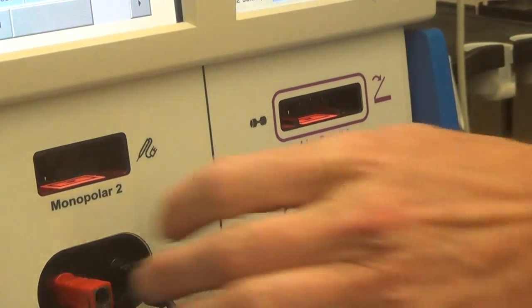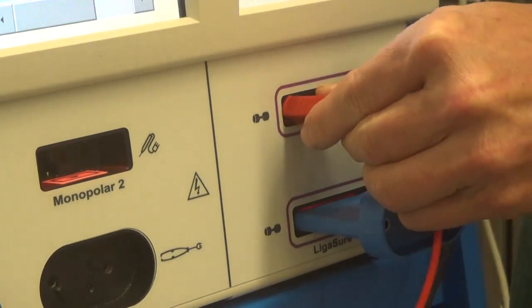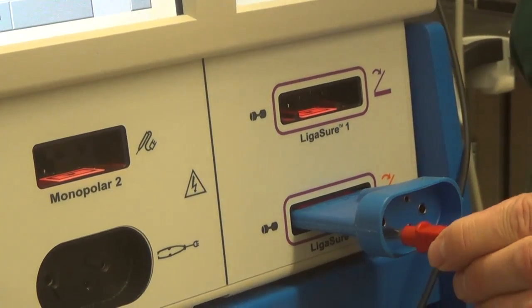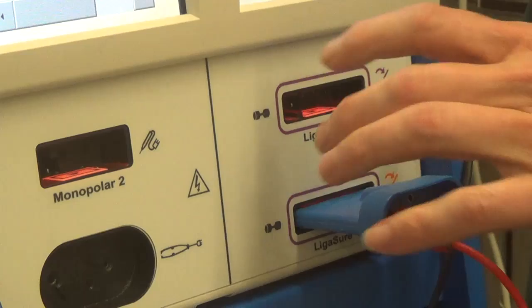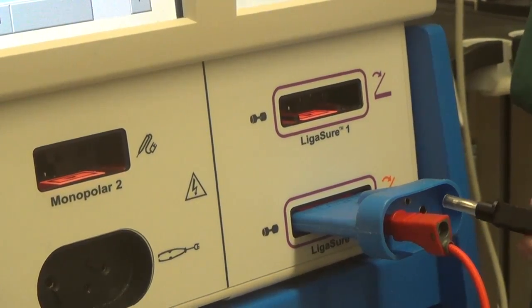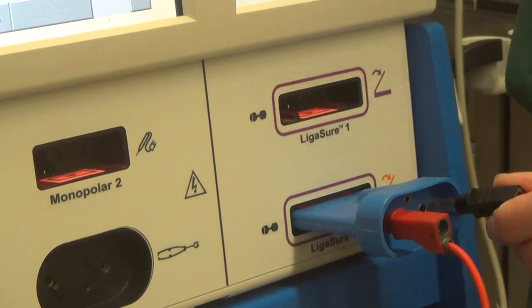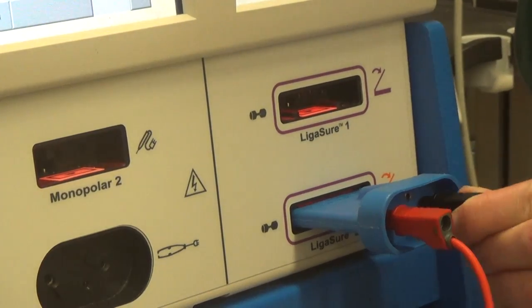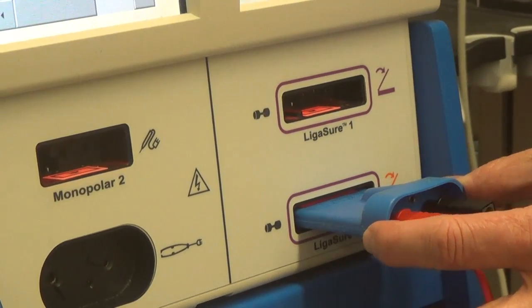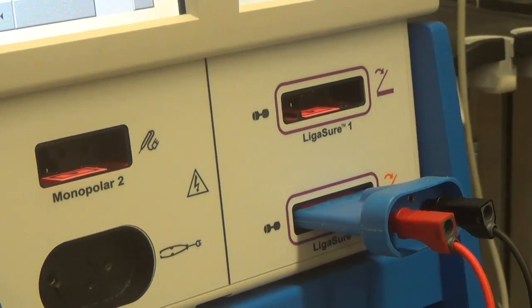Again, I like to use this because this enables me to use the shielded. The shielded won't fit inside the ligasure like this. But when you use the adapter, and everyone has the adapter because you're using up your old product, if you still have the old standalone ligasure handpieces, and you're probably ordering old standalone ligasure handpieces, this allows you to use them with your new ForceTriad.